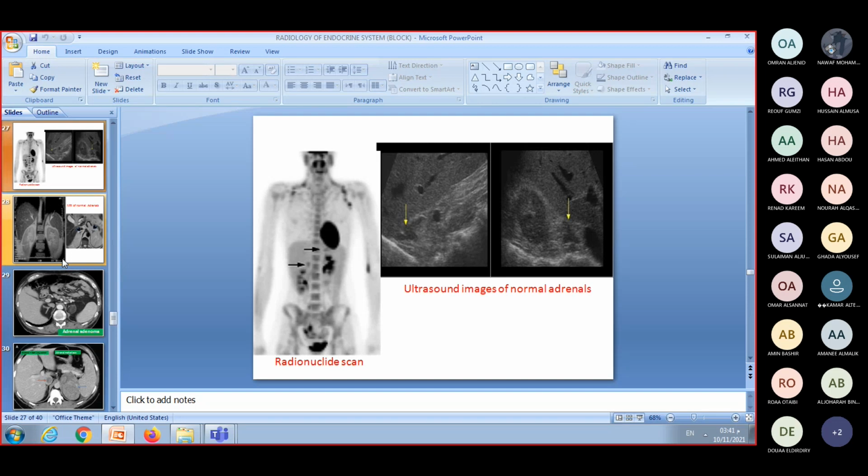Doctor? Yes, welcome. For ultrasound of the pancreas, does it give the same echoes as the liver, or higher than the liver, so it becomes brighter? Yes, well, according to the age; we are talking about adults. The pancreas is slightly hyperechoic, slightly brighter than the liver and spleen.